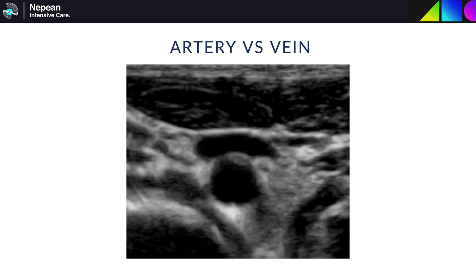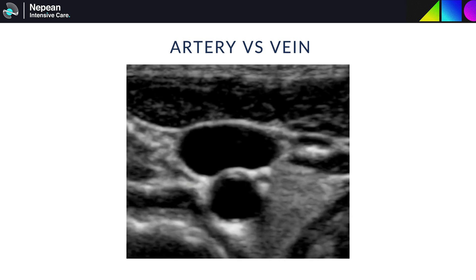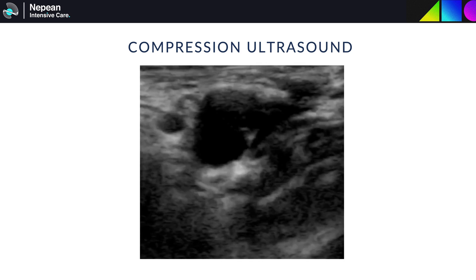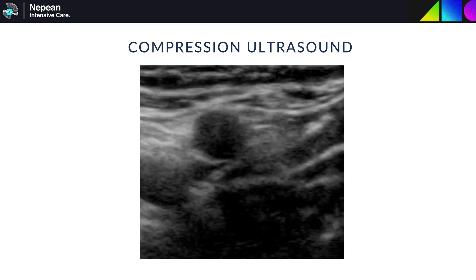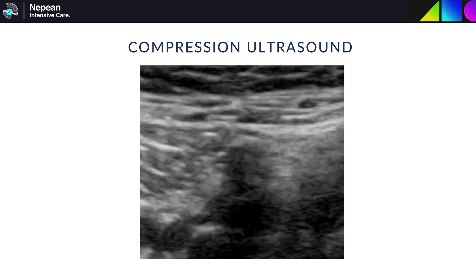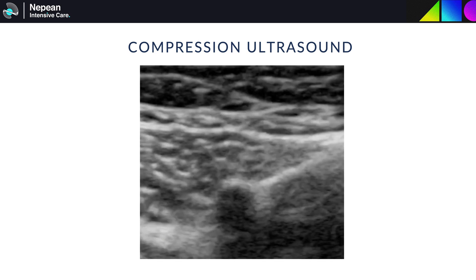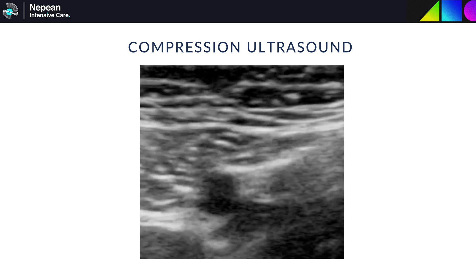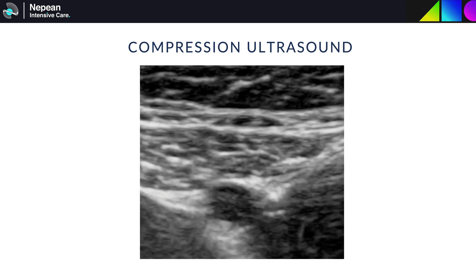Compression is a technique used to ensure wall-to-wall opposition of the vein, and is shown here in the video of the internal jugular vein. Compression ultrasound for DVT is performed by delivering downward pressure at 1-2cm intervals as the venous system is followed, as shown here in the lower limb venous system. Enough downward pressure should be applied to cause wall-to-wall opposition of the vein, but not completely compress the artery. If a clot is present, it's usually seen as a slightly hyperechoic structure causing a filling defect within the vein and preventing that wall-to-wall opposition.